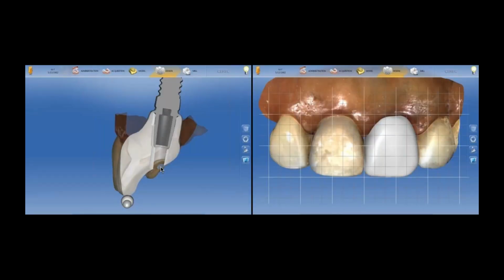Okay, so here you can see a very nice sagittal view of the design. You can see the implant, you can see the tie base, and we have a screw access hole right at the cingulum. We have sufficient material thickness surrounding the tie base, 360 degrees, and we also have a nice vertical running room to change the design from a circular platform, that's what we have on the tie base, to a very anatomical shape at the CEJ, as you can see here. So implant position is crucial, and it will relate to the success of your final ceramic material.